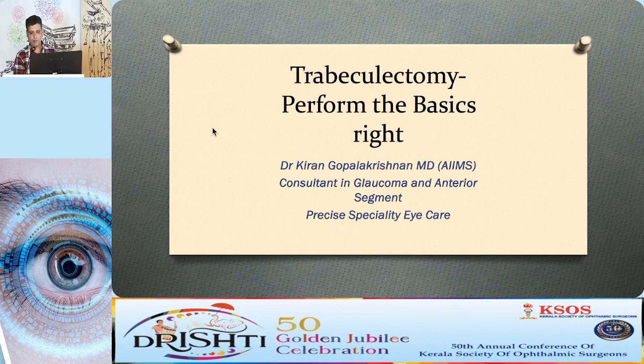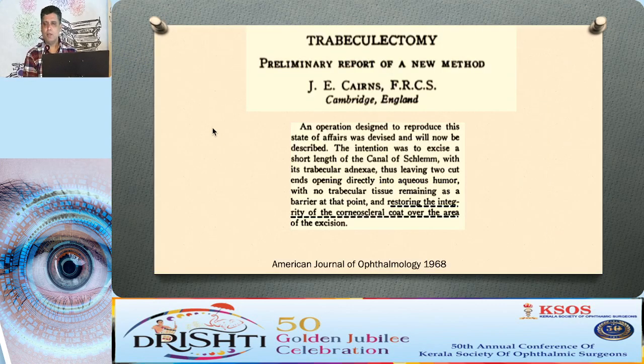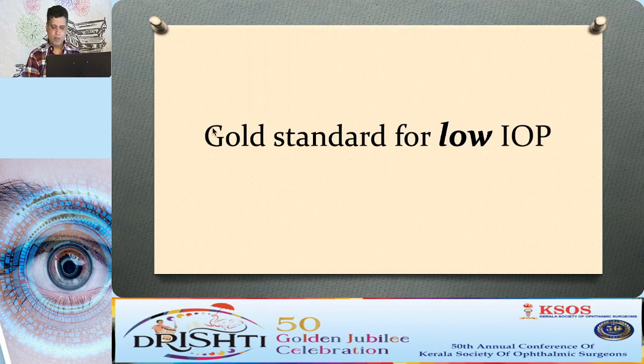If you want to filter like a pro, you have to perform the basics right. Trabeculectomy is an old surgery that goes way back to 1968 when Dr. Cairns described the excision of Schlemm's canal along with the trabecular adnexae and then restoring the integrity of the corneoscleral coat over the area of the excision. It's the gold standard surgery to attain low target pressures.